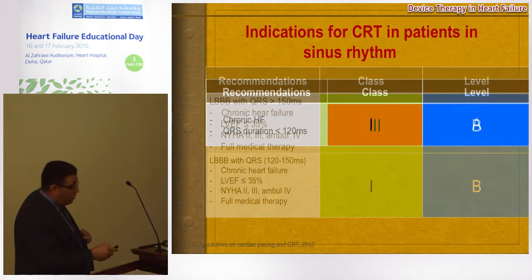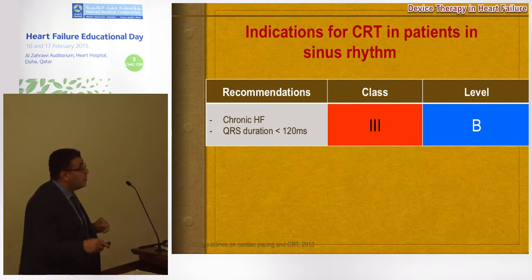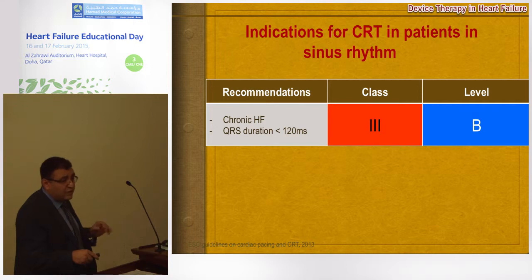One important thing also: in chronic heart failure, even if they are on good optimum medical treatment, if the QRS duration is less than 120 milliseconds, CRT doesn't work in this group.